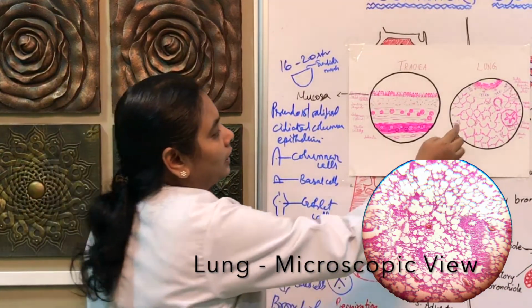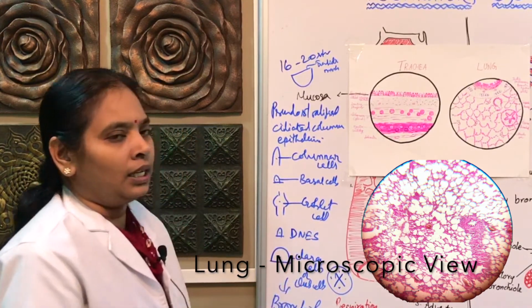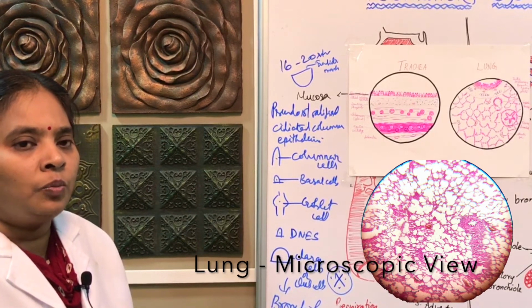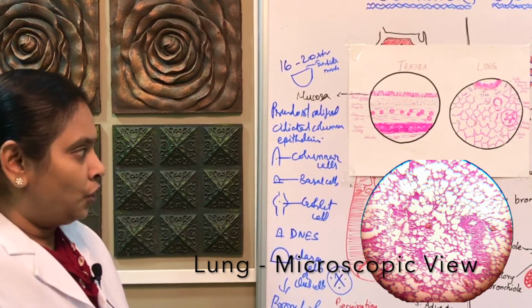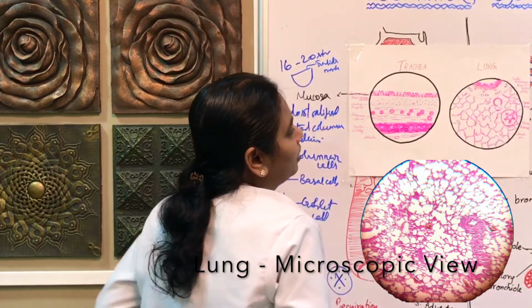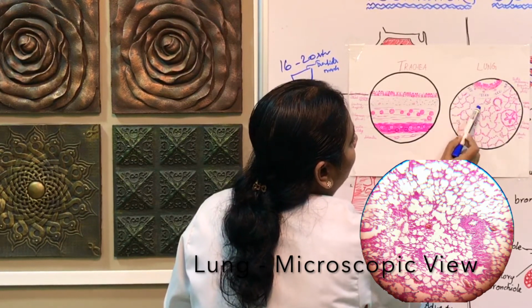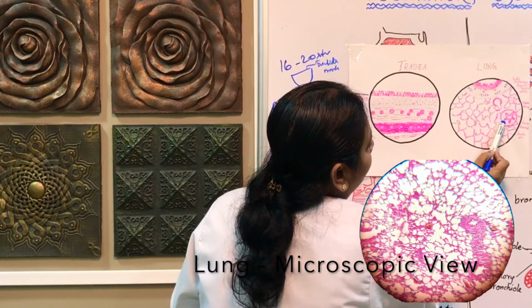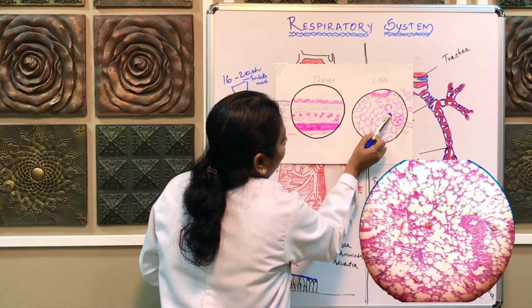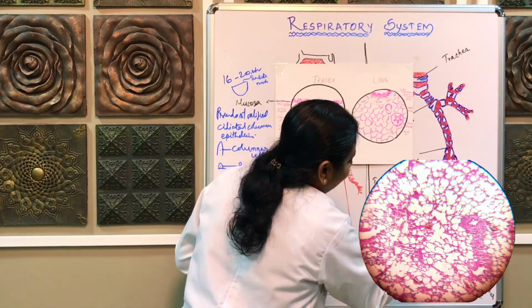Then next, from the respiratory bronchiole, the air pathway is not a conduction pathway, it is a respiratory pathway. So in the respiratory pathway, what happens everywhere is gas exchange. So this is one of the respiratory bronchioles. This is the specimen of the lung. Here you will see one portion of the intrapulmonary bronchus. Next one portion is the terminal bronchiole. Here you will see the respiratory bronchiole. The respiratory bronchiole is going to form the alveolar duct. So this is your alveolar duct.